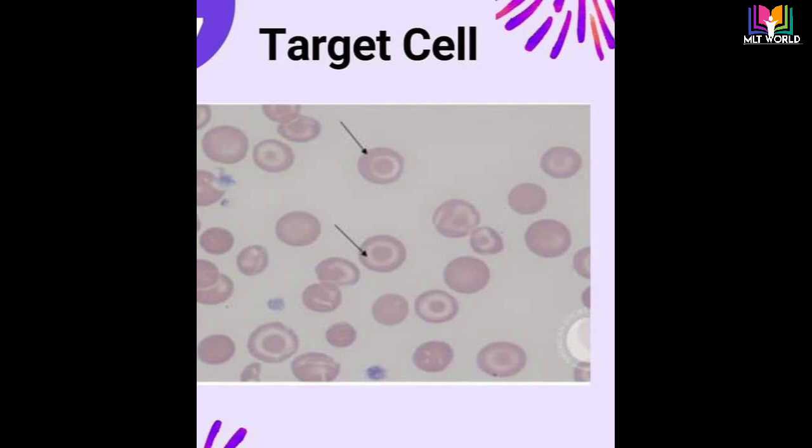Next is target cells, also known as codocytes. Target cells are red blood cells that have the appearance of a shooting target with a bull's eye. Target cells or codocytes have an excess of cell membrane relative to cell volume. Macrocytic target cells can be seen in liver disease, and microcytic target cells can be seen in thalassemia.